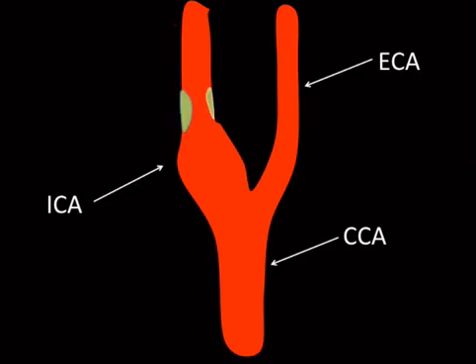Now, if you have an area of stenosis, just like anywhere else in the body, you're going to get a jet as the blood moves through that particular region. The velocity at that area is going to be increased. So measured here might be similar to here, but then when you measure it here, it's going to be increased. And then you measure it here, you might get a dampening of the waveform. That's the general idea. And somebody along the line has done a paper that said that a certain velocity increase is equal to a certain degree of stenosis, and that is a testable number.